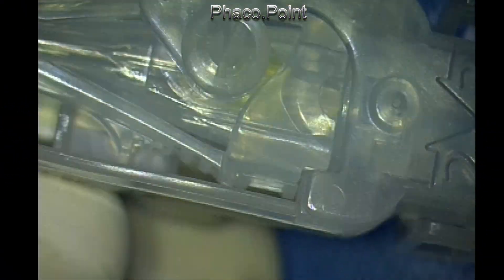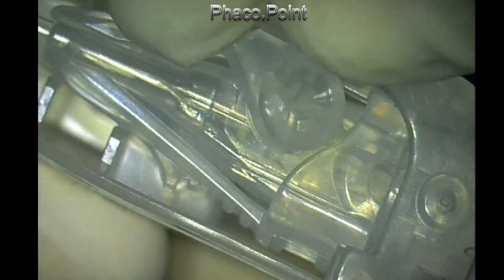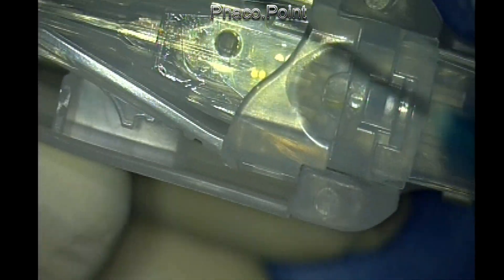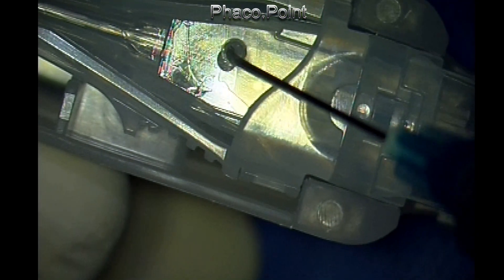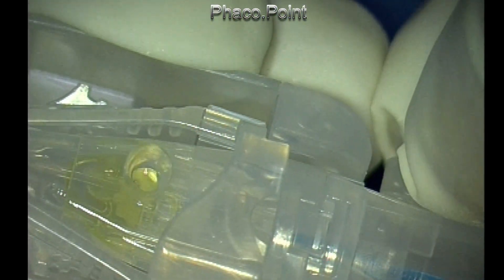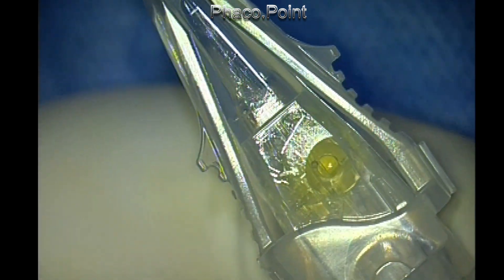This is the pre-loaded system of the injector, conveniently numbered one, two, and three. Point one: remove the restraining bung that exposes a small perforation. Two: the overlying cover, which will enable you to take the injector out of the packaging system. First, inject the viscoelastic — preferably methyl cellulose — through the nozzle up to the preferred mark. Then number three, which is also intuitive: this helps you load the intraocular lens into the nozzle.